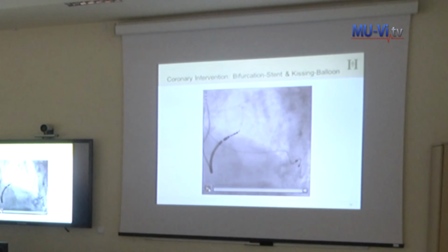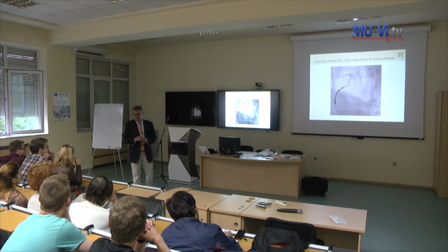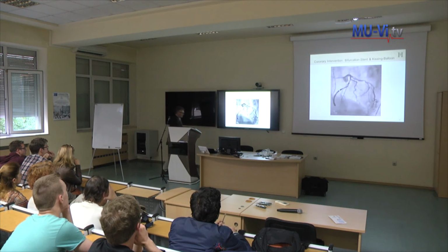It depends on the stenosis, whether it's calcificated or not. You have a feeling for it. You see what happens in the vessel, and you see long, some seconds, 4 or 5 seconds. For this we needed 18 bar for this kissing.